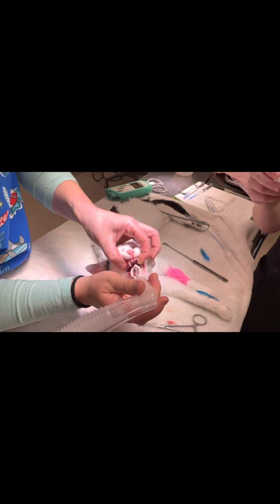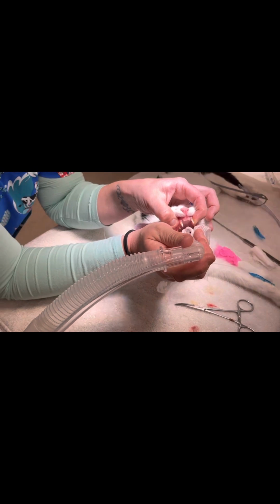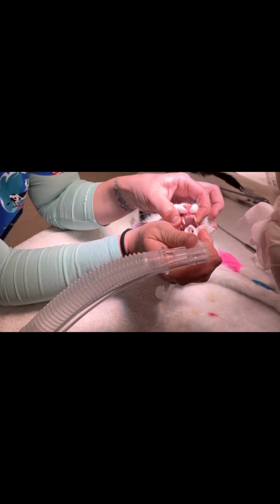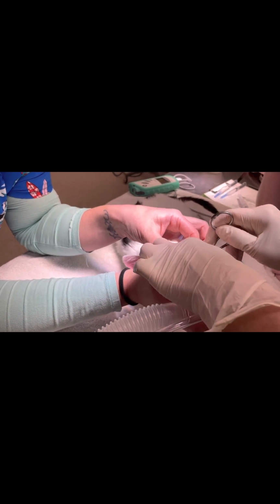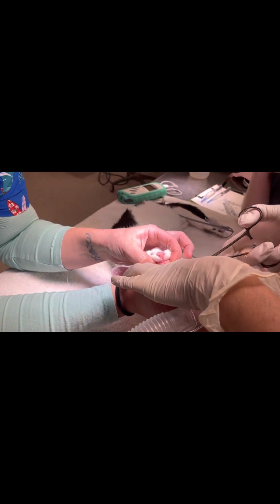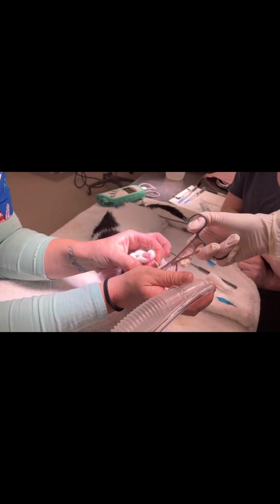Okay, now we always pack the throat with gauze because we do bleed. And that's it. It took us all of how long? They're huge too. I'm not going to argue that having a scope and doing this with a specialist and looking isn't all great, but otherwise these guys suffocate, and there's no reason why that should happen.